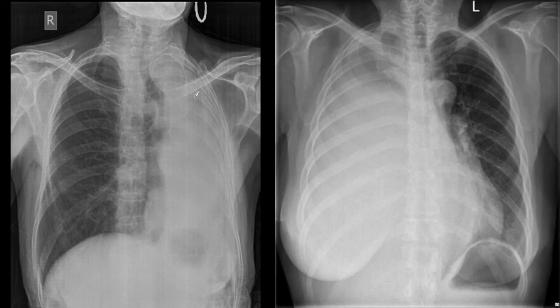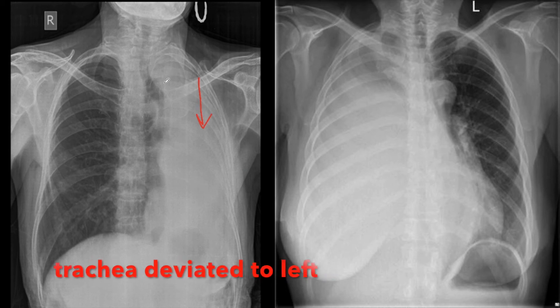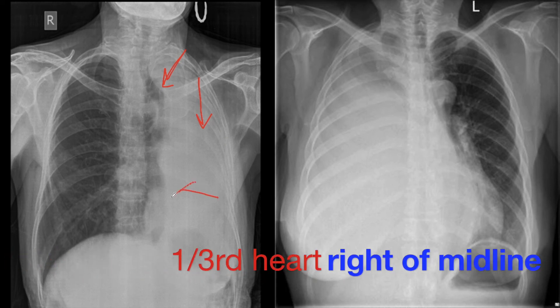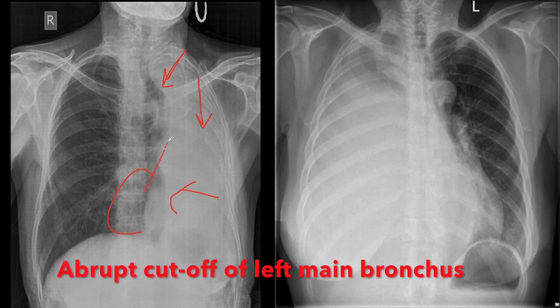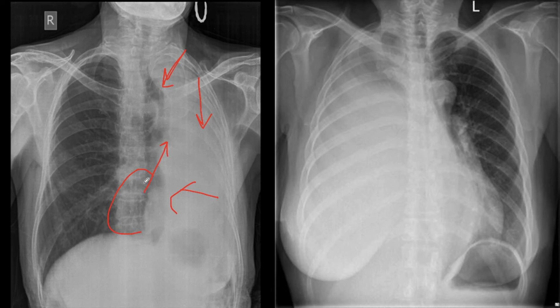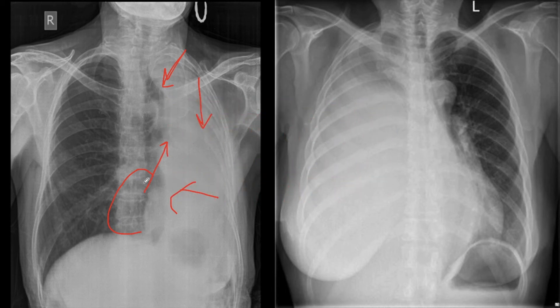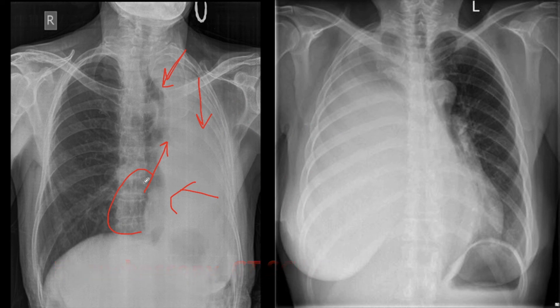In the first image, we can appreciate the following things: the left hemithorax is opaque or whiteout; trachea is deviated towards the left side; mediastinum is shifted towards the left side. Always remember that one third of the heart should lie to the right of the midline, but in this case there is no part of the heart lying to the right of the midline. Abrupt cut-off of the left main bronchus is also seen. So, with these features of volume loss, we can say this is a case of left lung collapse. The next step is either bronchoscopy or a CT scan to find the cause of collapse.